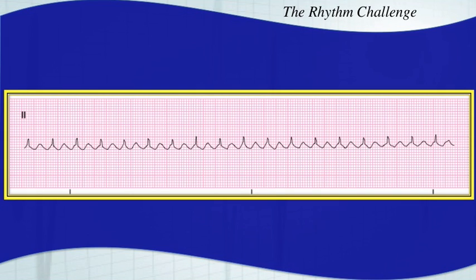These often confuse people, but this is a 2-to-1 atrial flutter. If you could just continue these sawtooth patterns right through the QRS complexes, or cover the QRS complexes, it becomes very easy to see that sawtooth pattern. Or if you just flipped it upside down in your head and saw the sawtooth pattern going across the bottom, it might make it easier. It's a 2-to-1 atrial flutter.